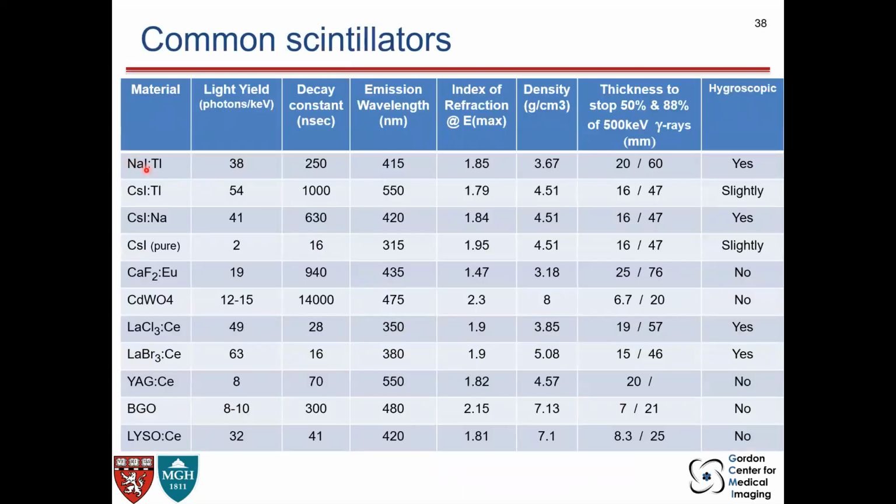So for the conventional scintillators, using this slide from before, the conventional scintillators are sodium iodide and cesium iodide for SPECT, the first 2 lines, and the last 2 lines are for PET. These are very easy to get. You can grow these crystals as a single crystal in large volume, and the price is very decent compared to CZT. To put it into perspective, the best price for a CZT detector is about $100-something per cc.